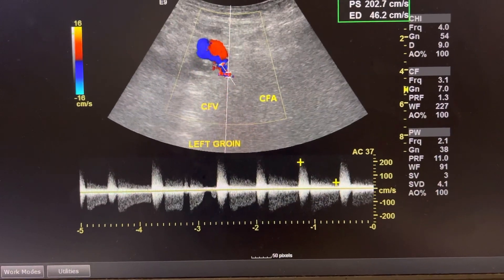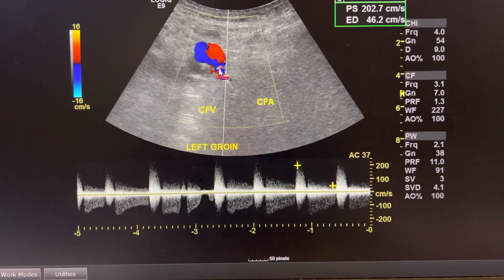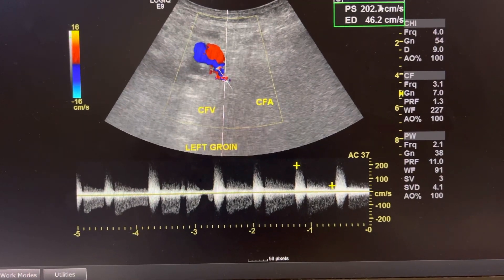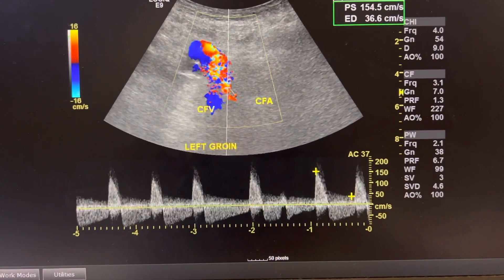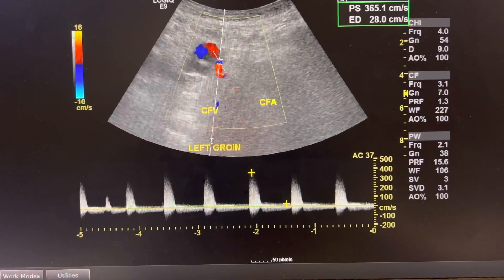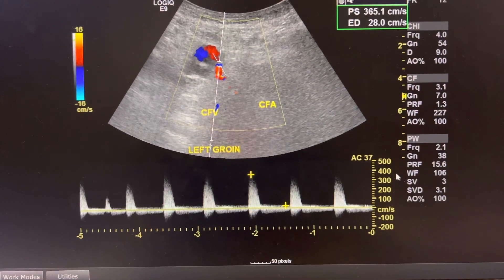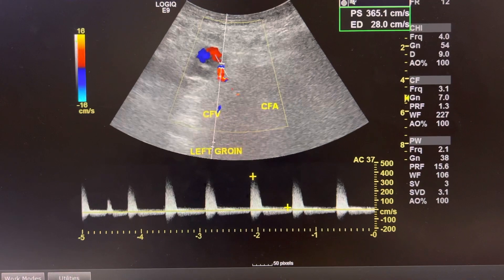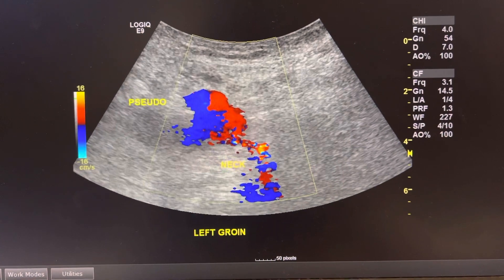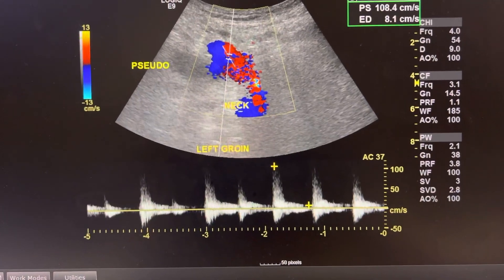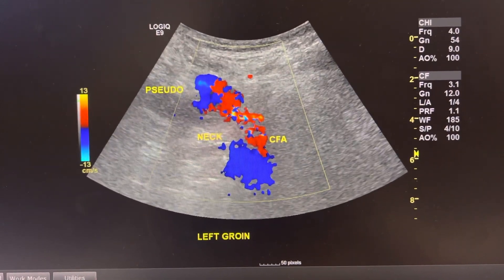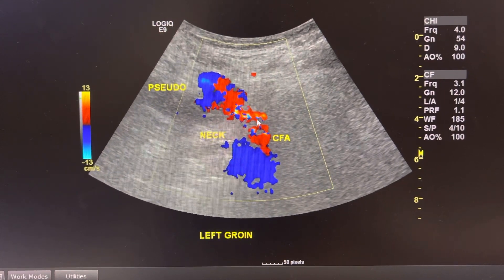I took a whole bunch of pictures to document it, and I Dopplered the neck of the pseudoaneurysm to show that there are abnormal waveforms and that the velocities are elevated. You can see here at the pseudoaneurysm it's really high and elevated. I wanted to make sure I was capturing the pseudoaneurysm with the connection to the CFA as best I could.